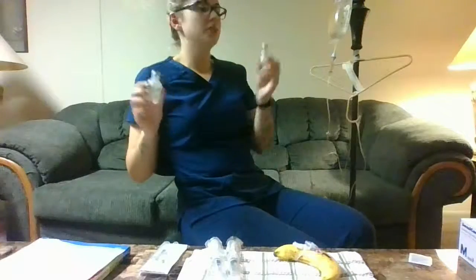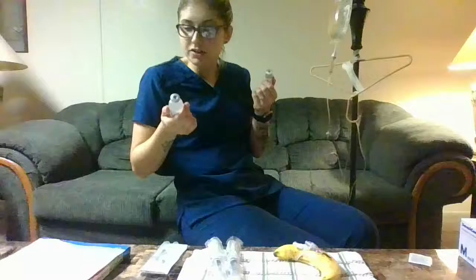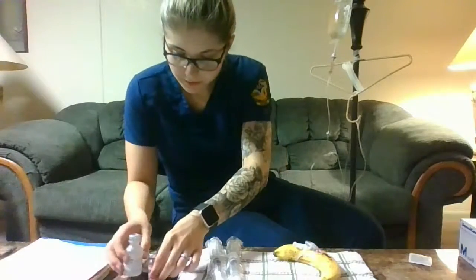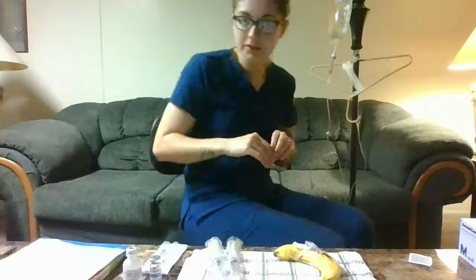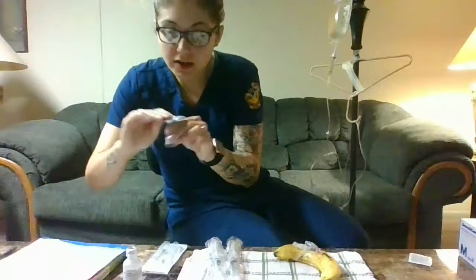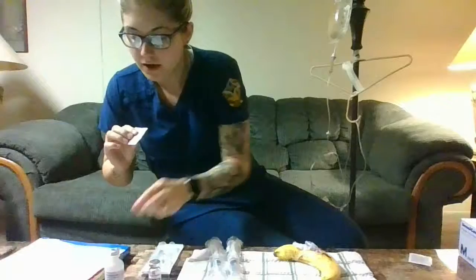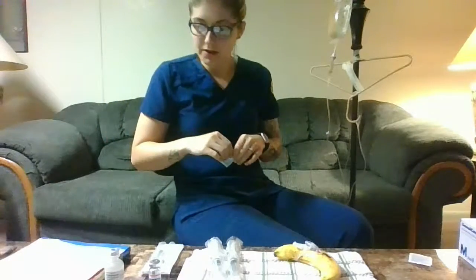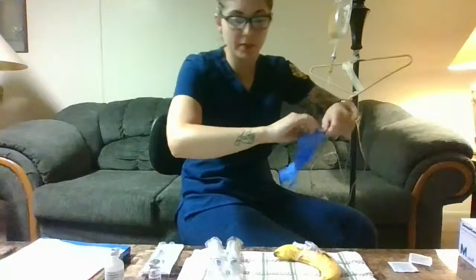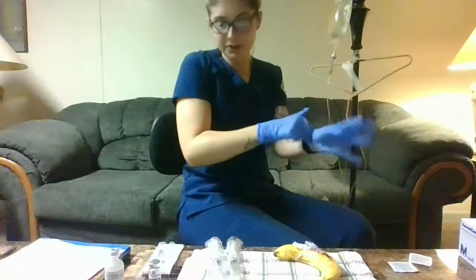When you're getting your medication, you want to check the expiration dates, look for any cracks, particulates, any weird discoloration, anything like that. So these all look good. We're ready to get our medication ready. We're going to clean the top of the Dilaudid, clean the top of the normal saline. Then we're going to get our needle out to draw up the medication.